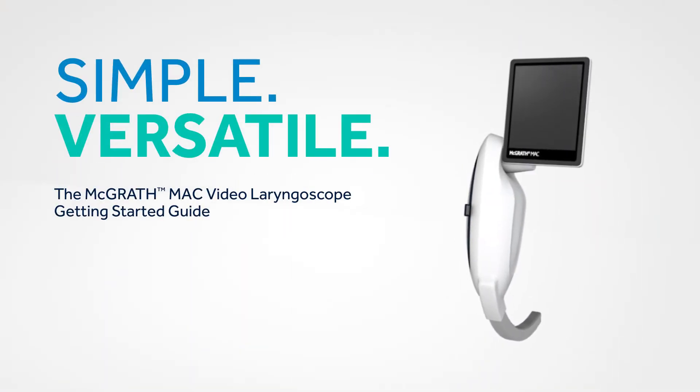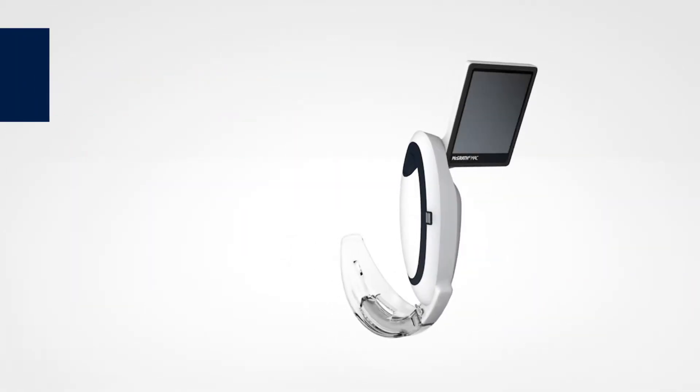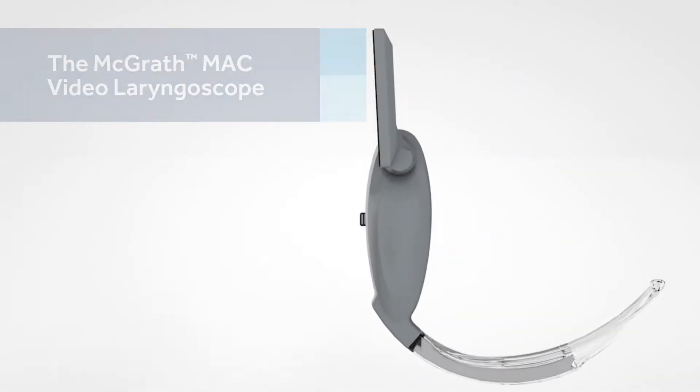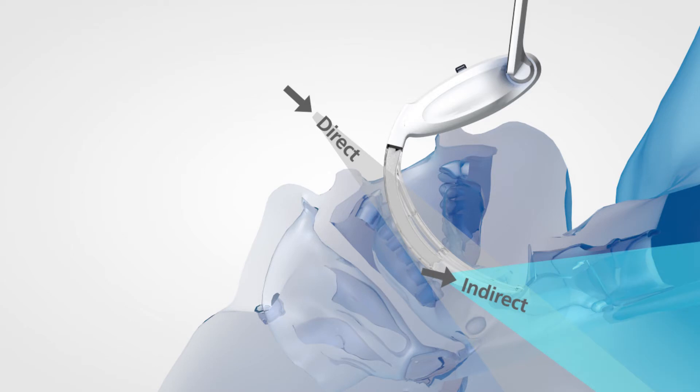The McGrath MAC Video Laryngoscope is the latest in video laryngoscopy technology. It is an ideal OR, ICU, and ED solution for a variety of patients. The McGrath MAC Video Laryngoscope can show both direct and indirect views. This versatility puts a wide range of capabilities in the palm of your hand.